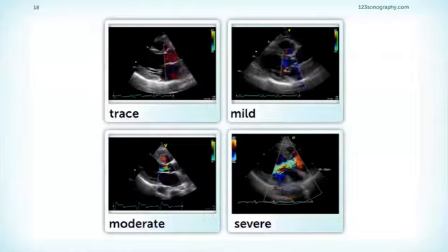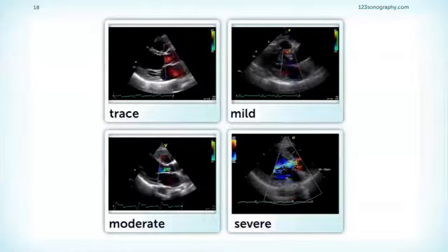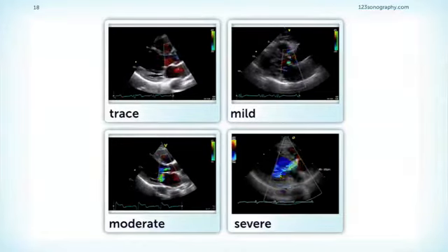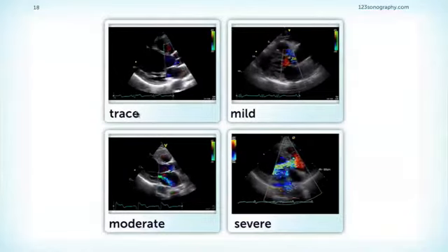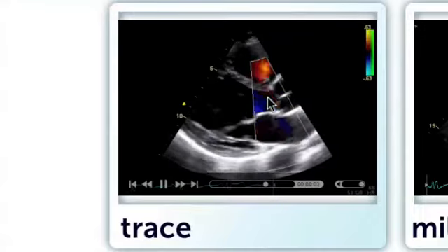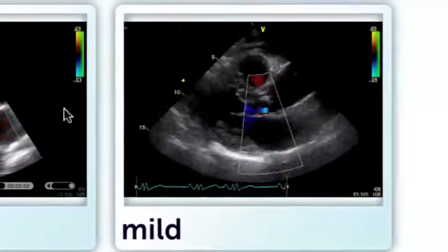Put all these things together, it will not be difficult at most times to really quantify aortic regurgitation just by looking at the size and the different features of the jet. This is just to show you how we would quantify aortic regurgitation. This patient has only trace aortic regurgitation. You hardly can see a jet here. There's no flow convergence zone you see.